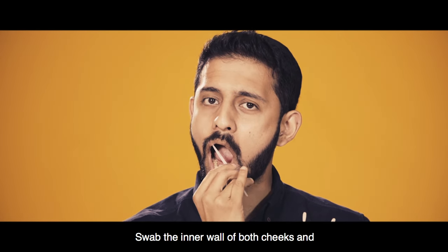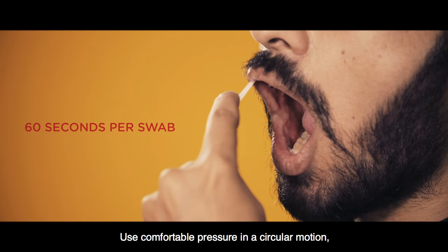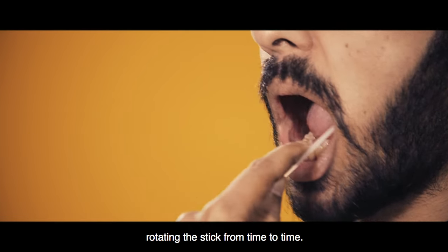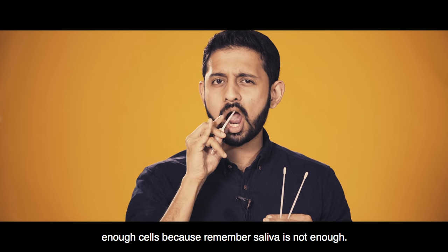Swab the inner wall of both cheeks and the gum lining of the upper and lower jaw for 60 seconds. Use comfortable pressure in a circular motion, rotating the stick from time to time. Make sure to firmly swab your cheeks to collect enough cells because remember, saliva is not enough.